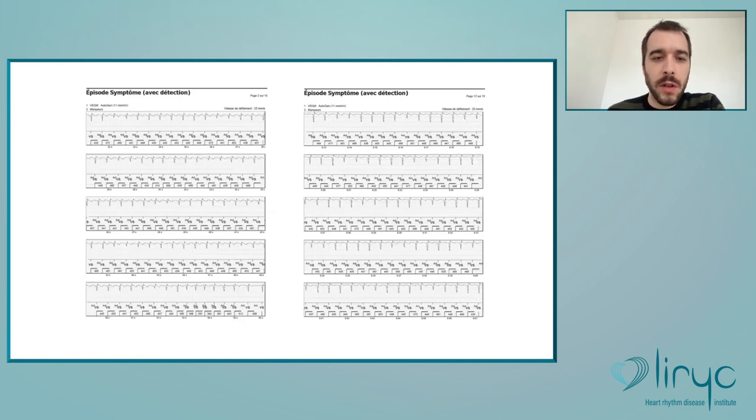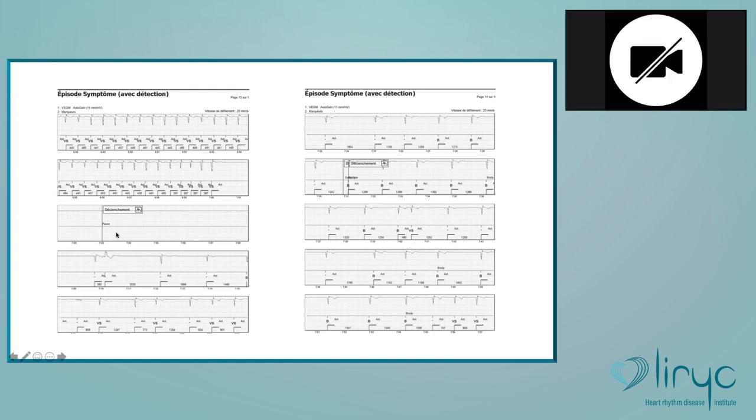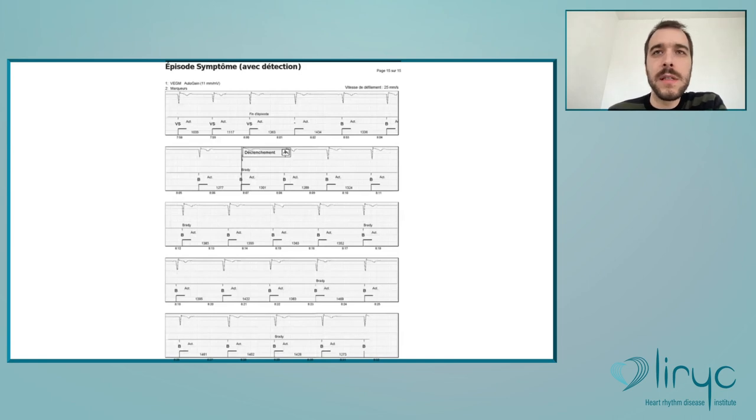And then it goes on like this for a few minutes, and then you have this. So what's going on here? Heart rate is about 140, and then you have a sudden drop. No QRS. You have the trigger here. It's in French, but it's the trigger for the pause detection. And then once again, nothing. One cycle here in transition, one PVC. And then a little bit later, you also have the criteria that are fulfilled for the bradycardia with four cycles labeled as B. So this, in fact, given the context of paroxysmal AF, this episode is most likely consistent with atrial tachycardia, like atrial flutter, with a conversion pause of 9 seconds.